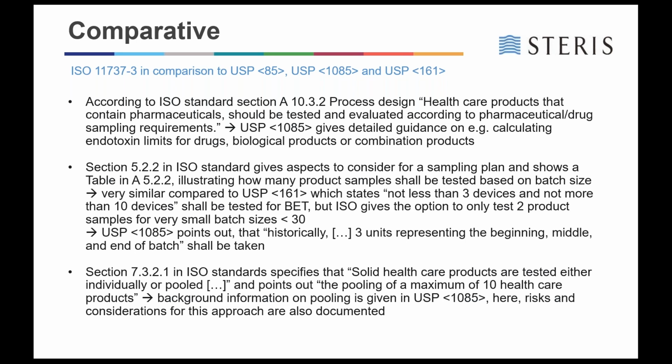However, there's no background information in the ISO standard on pooling itself. And this you can find perfectly detailed in the USP 1085. Here are also some considerations given and some risks are detailed with respect to the pooling approach.